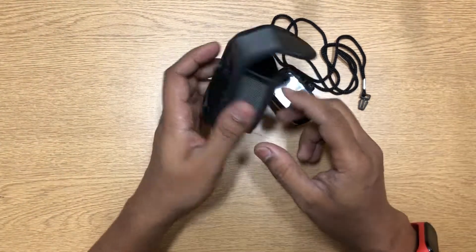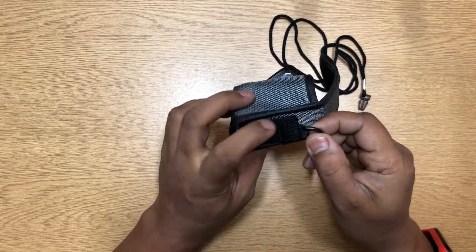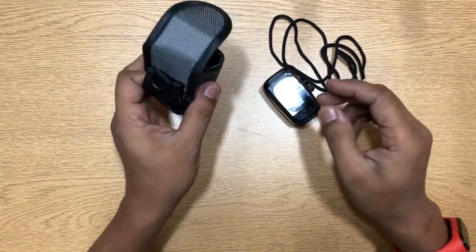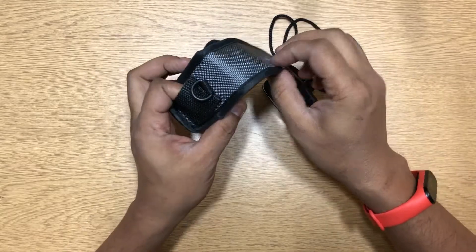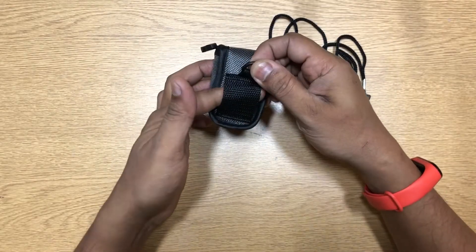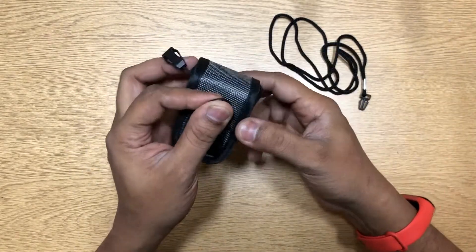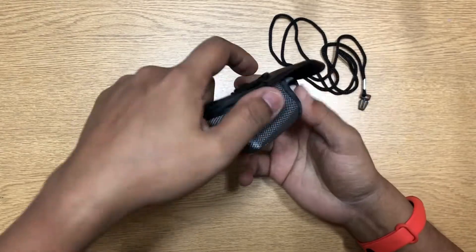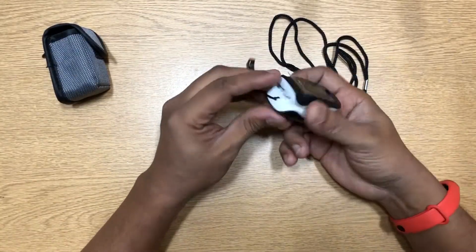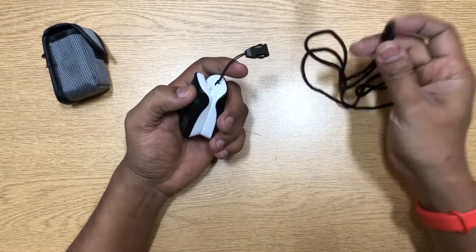You get this carrying case, which is actually pretty good — very solid. I haven't really been carrying it around, but if you want to you can put the device in here. It has a belt strap and a strap where you can put a hook and keep it that way. Very good quality. You also get an extra neck strap in case you want to keep it around your neck all the time.